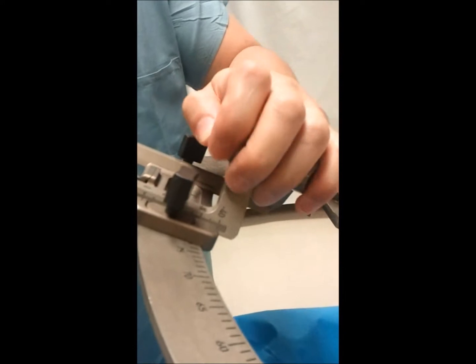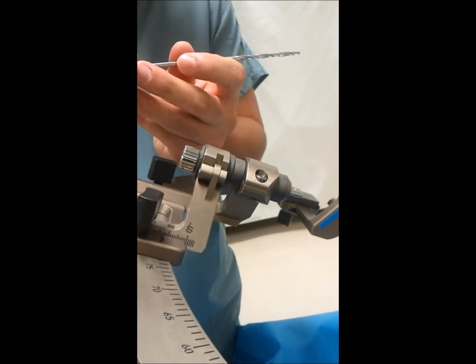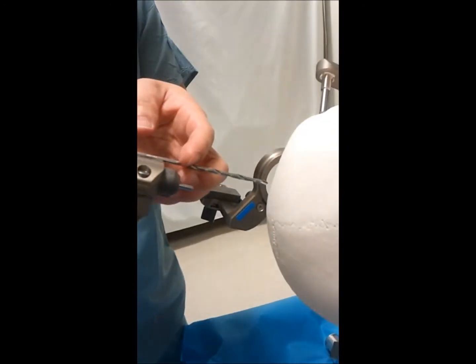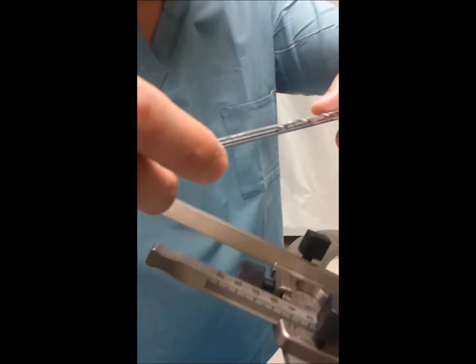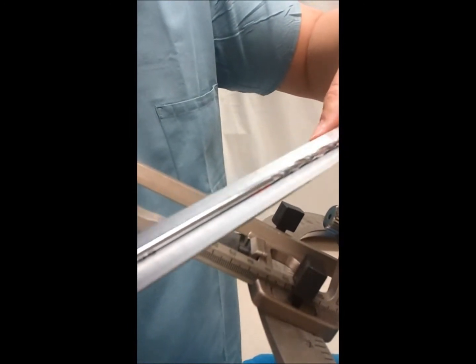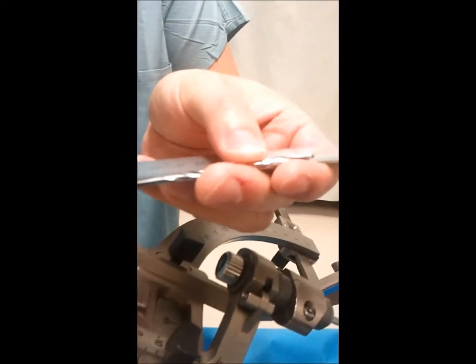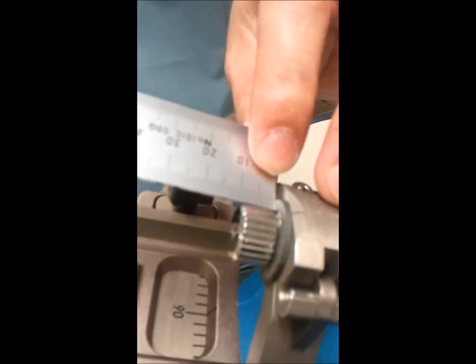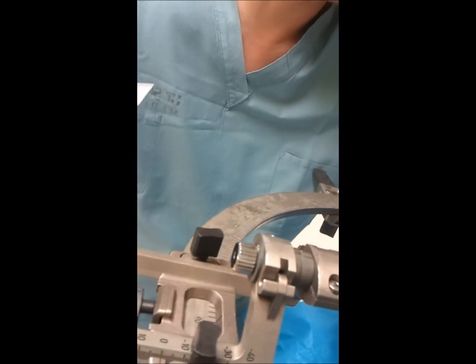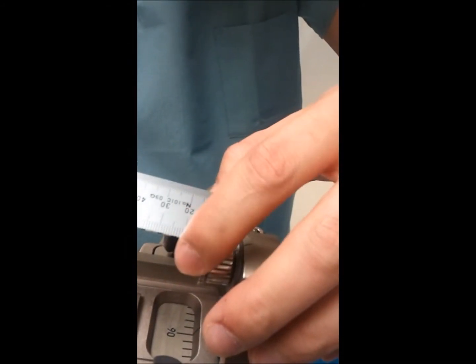and we're trying to measure how far we should have our safety nut catch device here down in. Well, the way we can do that is take our ruler and measure 190, which we can't get to, but we could measure on our biopsy needle 190 here, and then add the offset of whatever device we're using. And in this case it's 10 for this component, and pretty much standard will be another 2 to add, make it 12. As you can see there, that's about 12 millimeters offset.